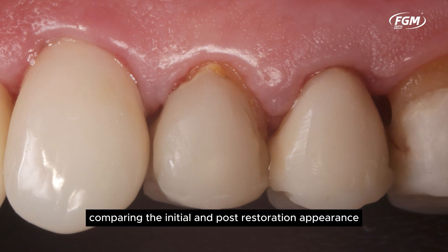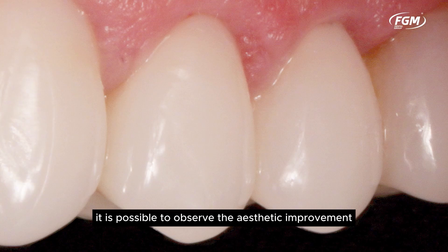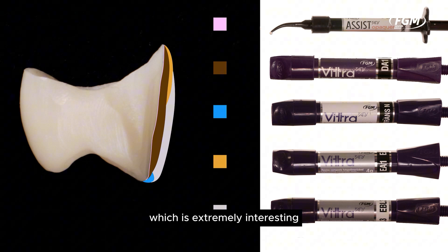Images comparing the initial and post-restoration appearance show the aesthetic improvement and the health of the periodontal tissue. In this didactic diagram, we present the layering sequence used, which is extremely interesting for replicating bleached teeth.